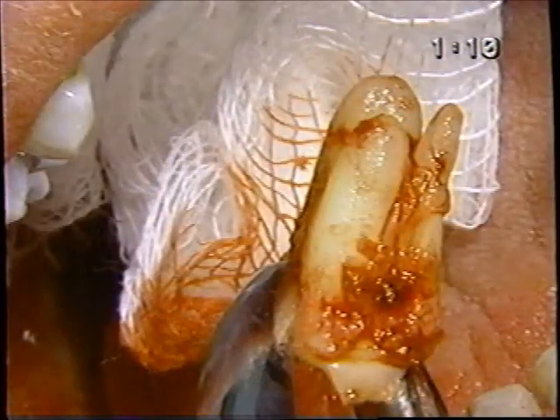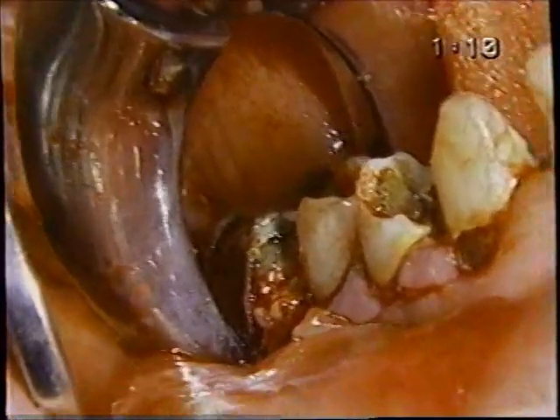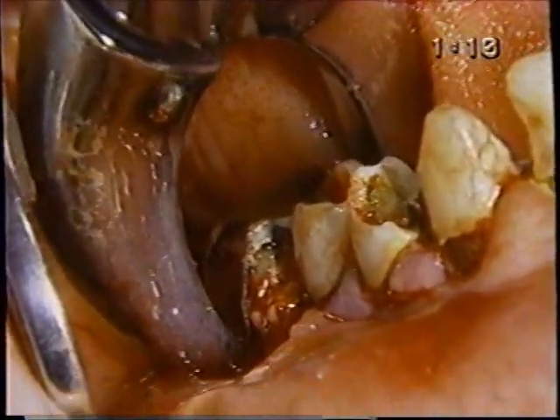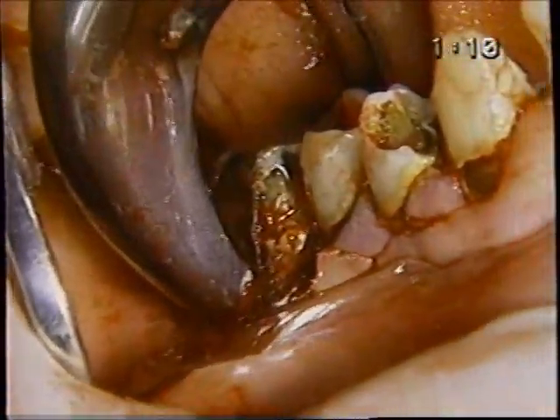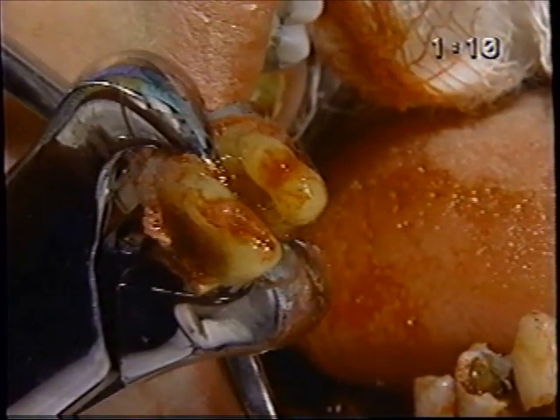Good. What we're doing here is luxation, buccal, lingual, buccal. Goes a little further each time, lingual. That's because bone is expanding. Buccal, lingual, a little figure 8. Doesn't do much. No broken roots. Even though we heard a crack, it was probably a little of the lingual plate as the tooth came out towards the buccal. But if it's attached to the soft tissue, even if it is fractured, we'll leave it.